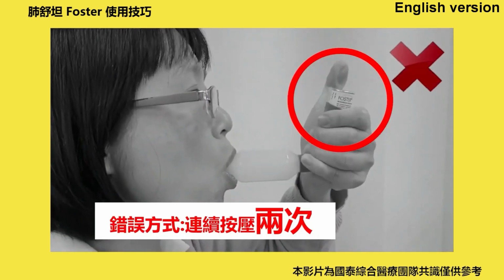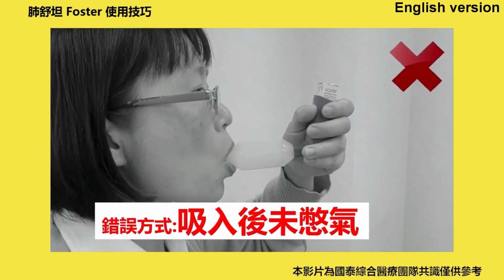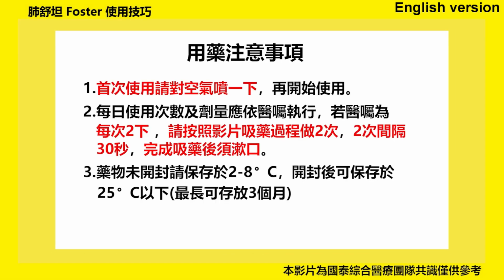It is wrong to press twice consecutively. It is wrong to take a big breath hard. Not holding your breath after inhaling is wrong.